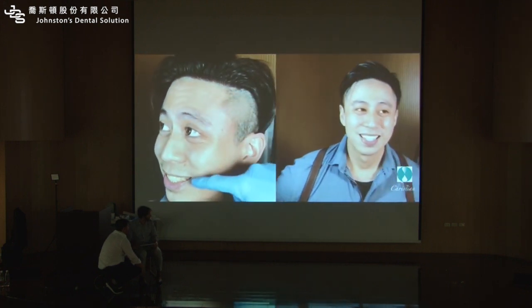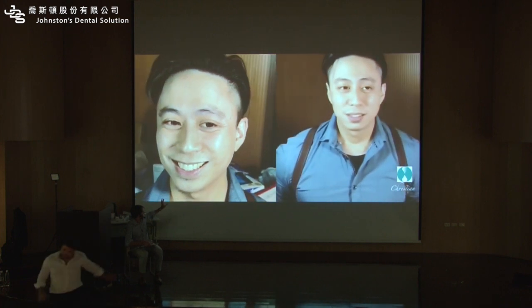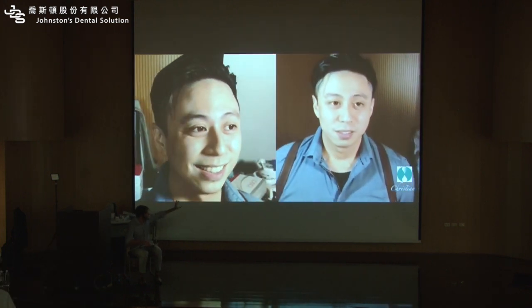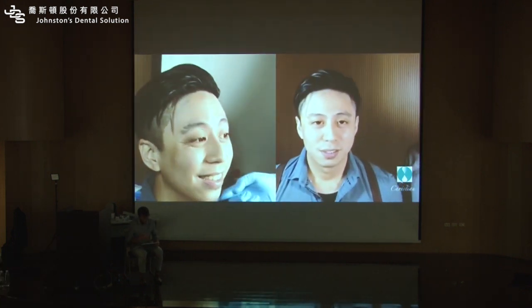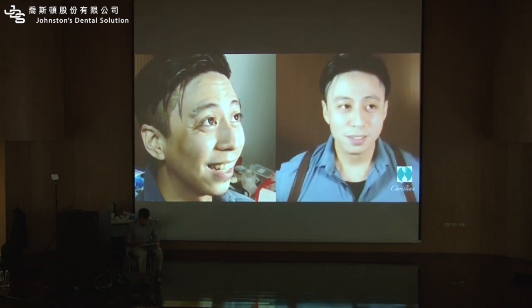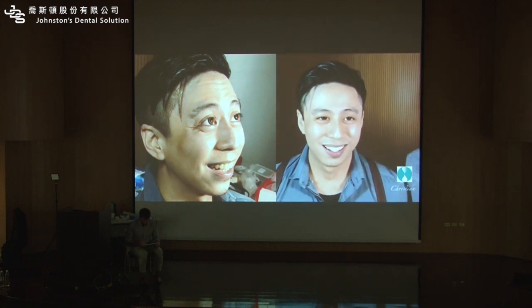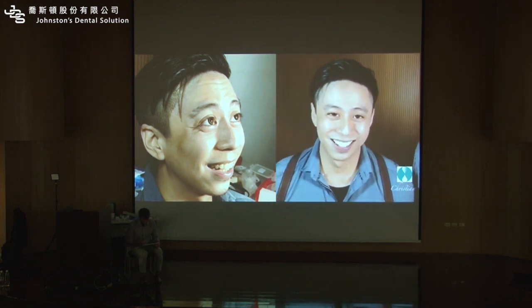Okay, so here the best thing is to pick 10-20 seconds from before, 10-20 seconds from after, so the patient can see the interaction here with his big smile.